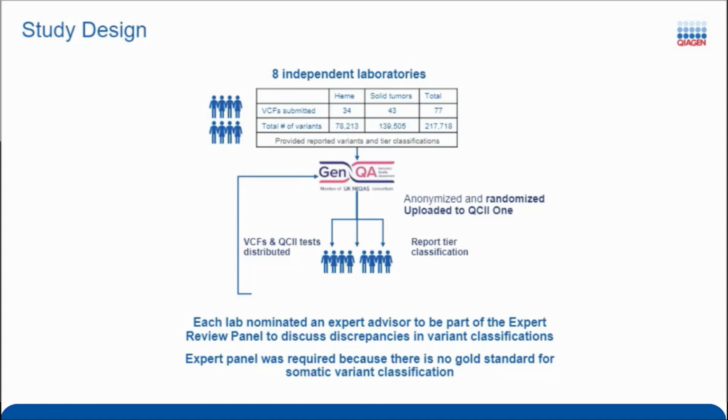So I'll stop there. I think there are technical things, how you call a variant; the second is what is the threshold for thinking that variant is important in any context; and the third is what is the likelihood that this variant at a certain VAF is actually important in this particular context. And I think all three of those play into this non-concordance.